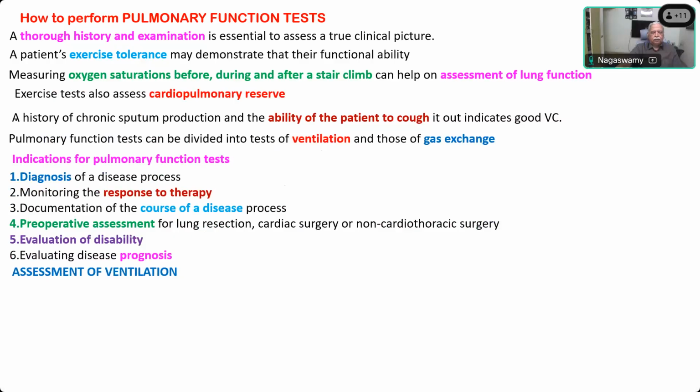Spirometry is part, but more than that. Movement of the air, how is it measured? Expiratory flow rate. Peak flow. This is a very important measurement that will decide whether the air is able to travel easily from the atmosphere into the lung and back after exchange.